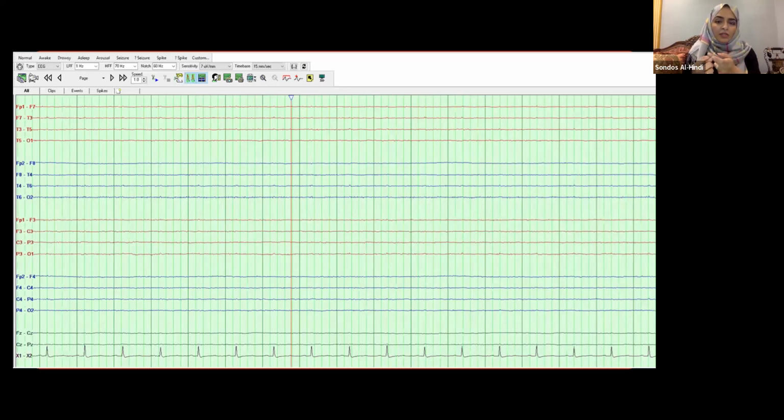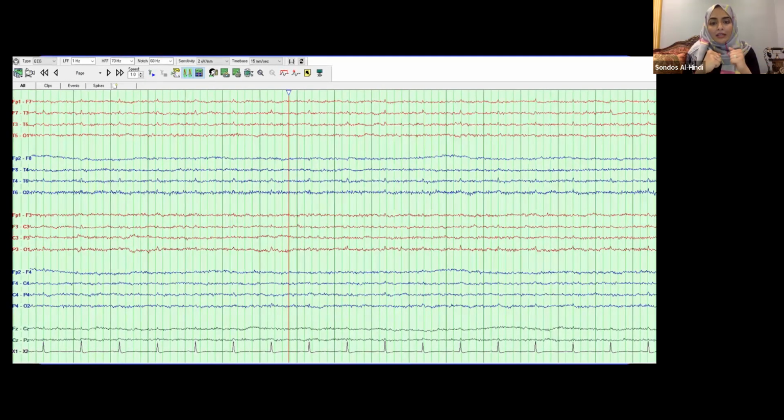Just before the apnea test, we had performed the EEG. So this is a snapshot of his EEG. Again, you would say this is a flat EEG. I could see some cardiac artifact, but again, be wary. We're looking at a 7 microvolt sensitivity. Changing it to 2, it goes on. You will see some underlying low frequency or low amplitude activity, but this is not a clear-cut alpha activity, theta activity, or delta waves. You're not able to see any waves. It's just a flat line with some EKG artifact.